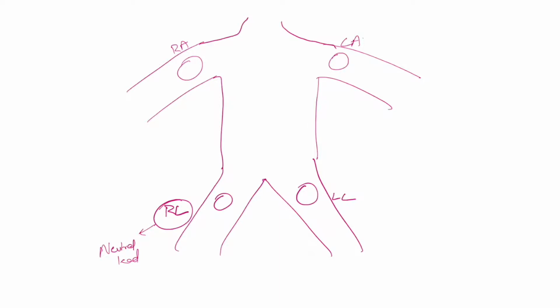Now, the convention the machine follows, so we don't have to do anything other than putting it on the person's body, is that the machine interprets the leads as being either negative or positive based on the specific scenario. So the right arm, the machine considers always negative for the present purpose. The left leg is considered to be always positive, and the left arm takes the opposite role.